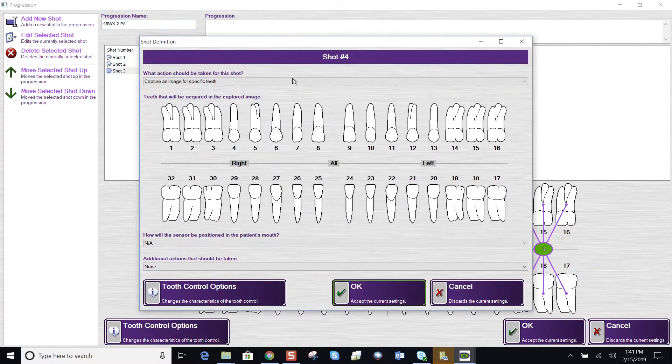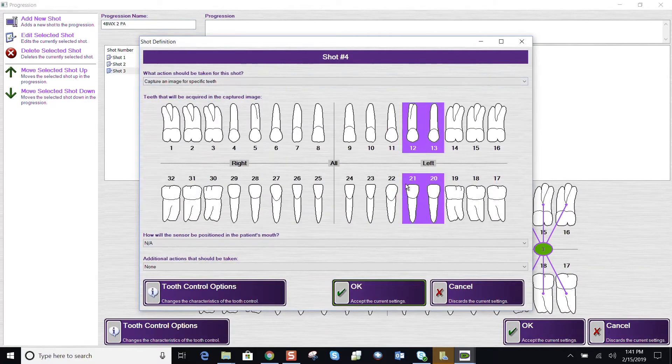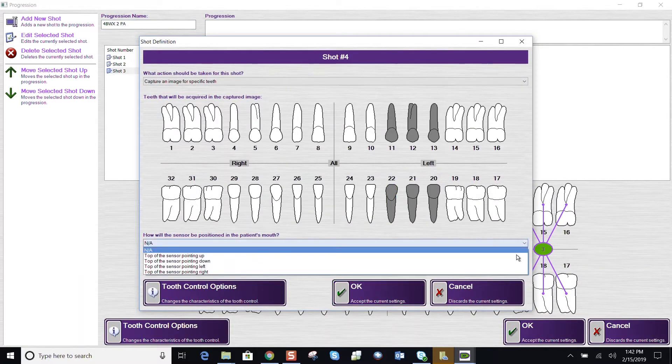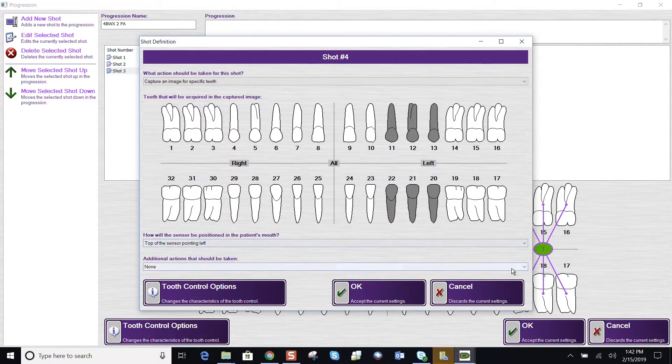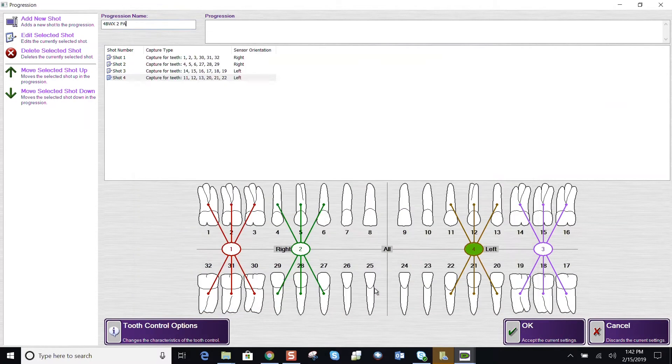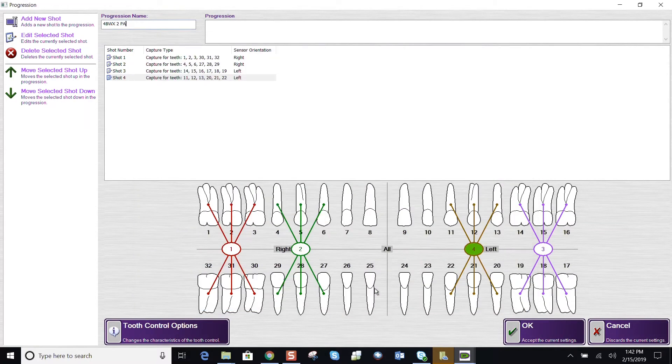Add another shot. My fourth shot would be my premolar bite wing. My sensor orientation to the left. It is the patient's left. Say OK.